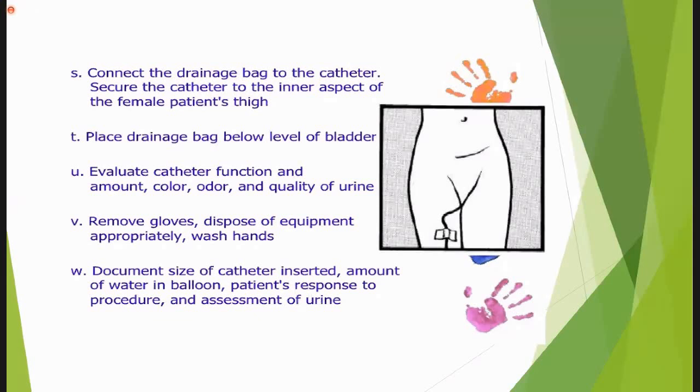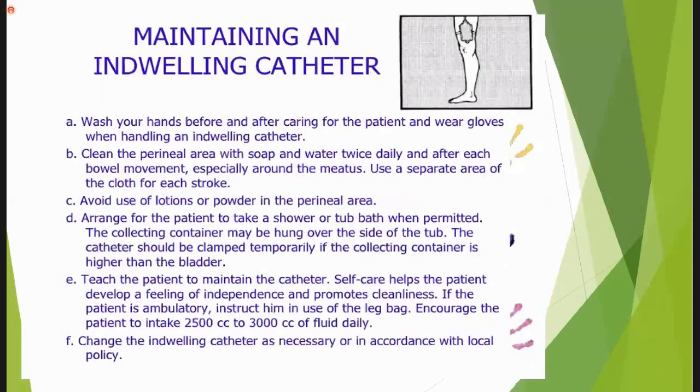At the end of the procedure, document the size of the catheter which you inserted, the amount of water in the balloon, the patient's response to the procedure, and the assessment of the urine. Okay. And now, maintaining an indwelling catheter.